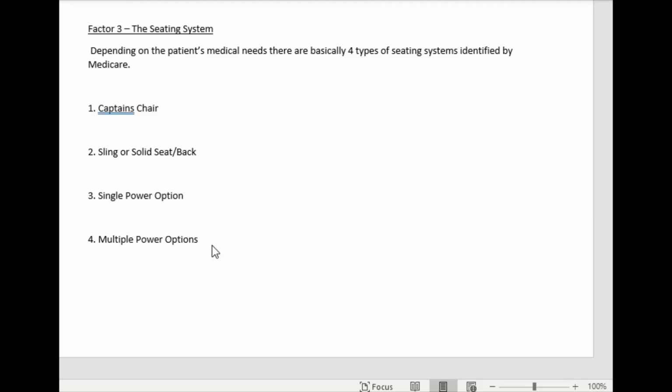If a patient were to use power tilt to perform independent pressure relieving activities, they would need to tilt all the way back to 45 degrees to have any sort of pressure relief with a change in center of gravity. If they were using recline only, they would have to recline their seat back to 150 degrees to facilitate a pressure relief.